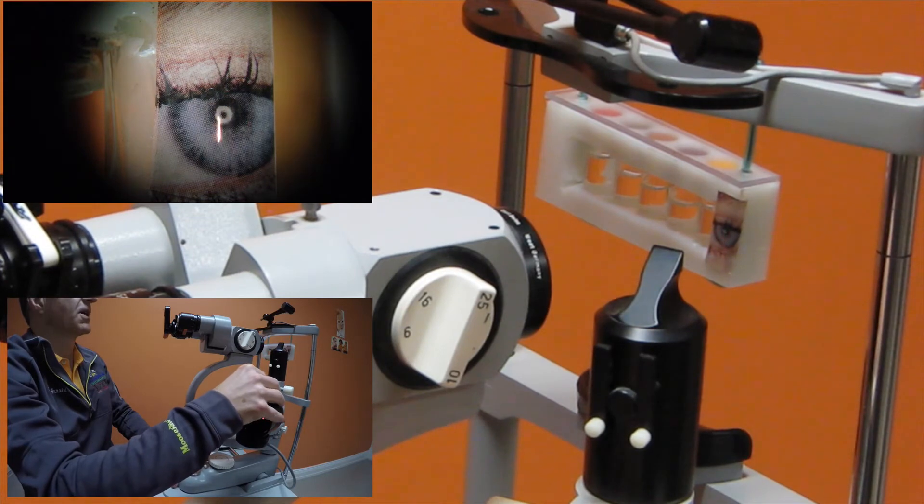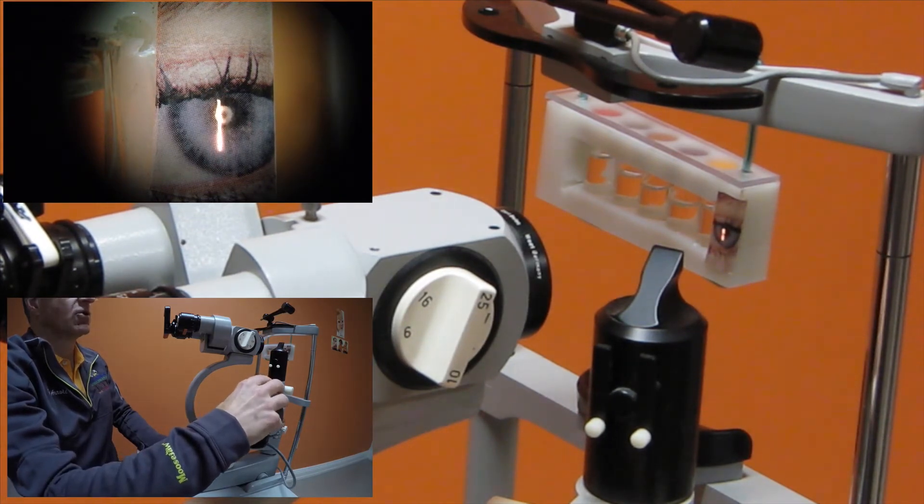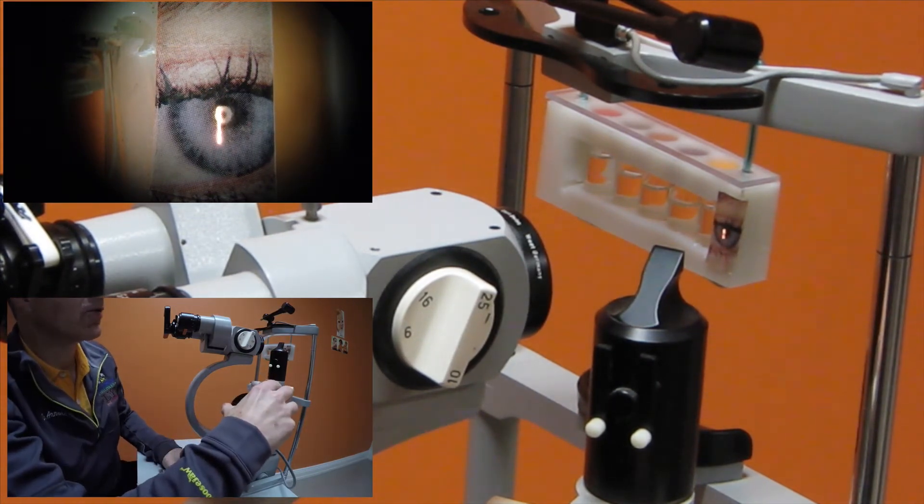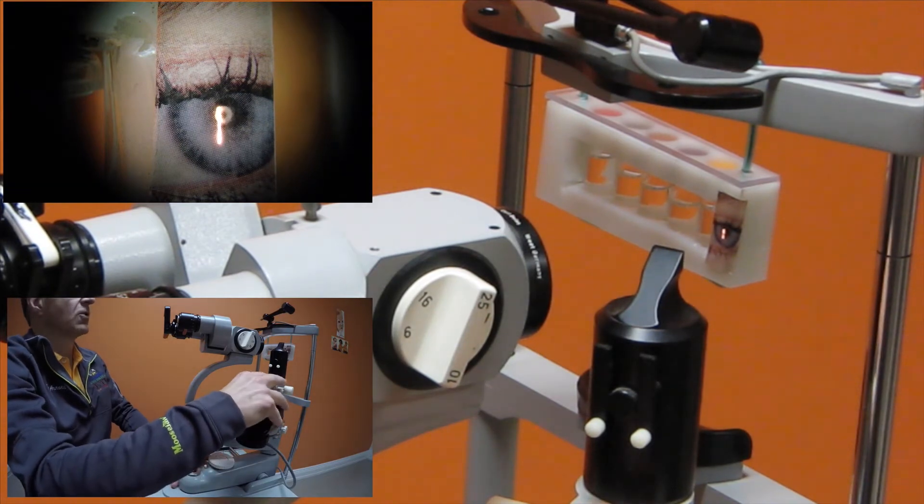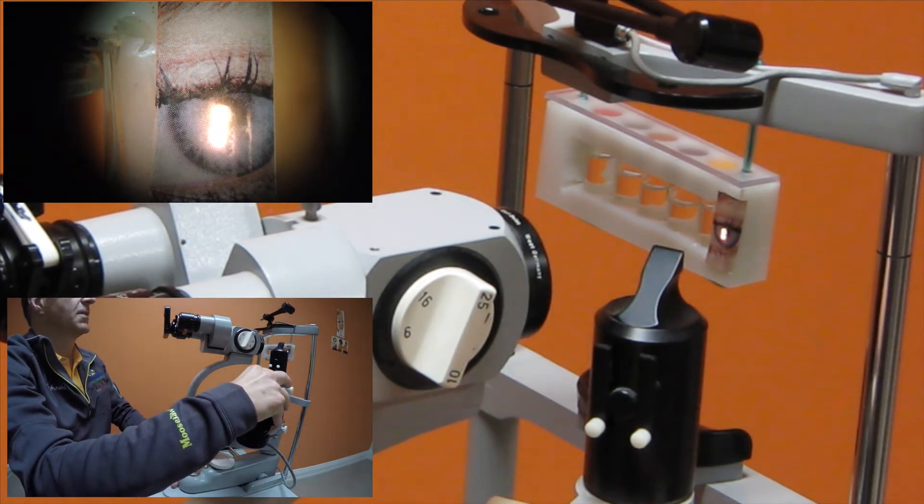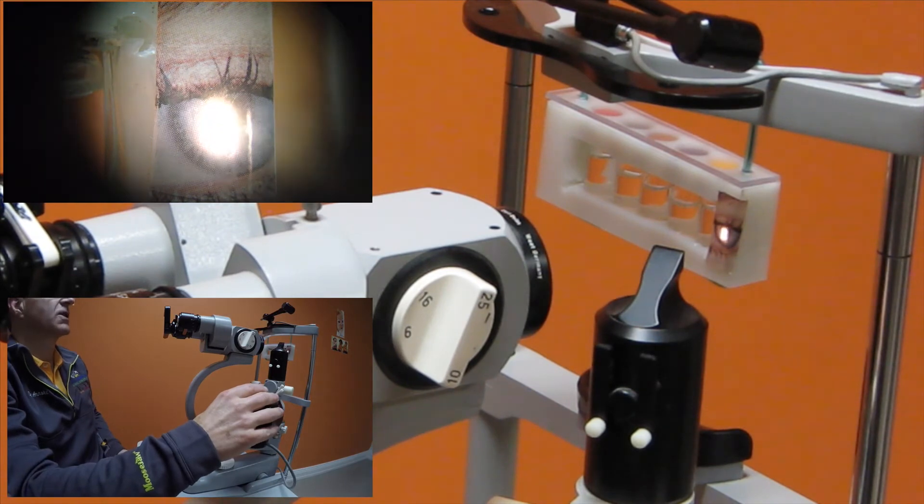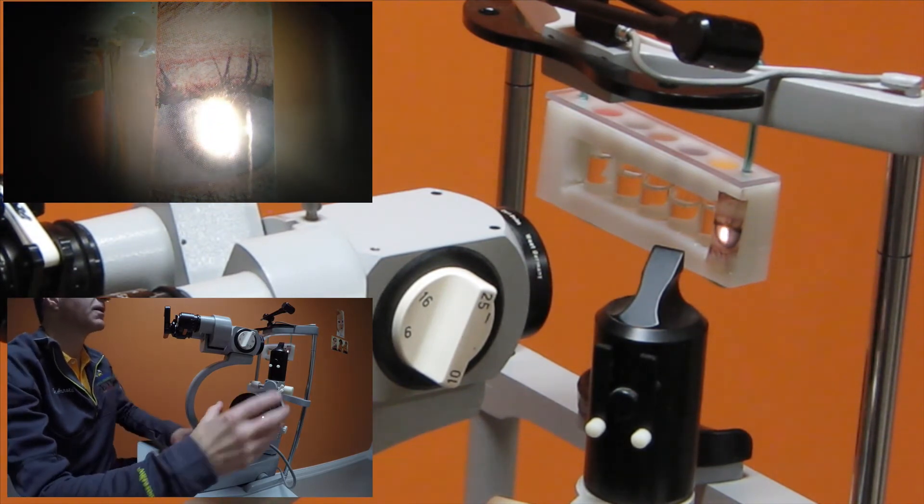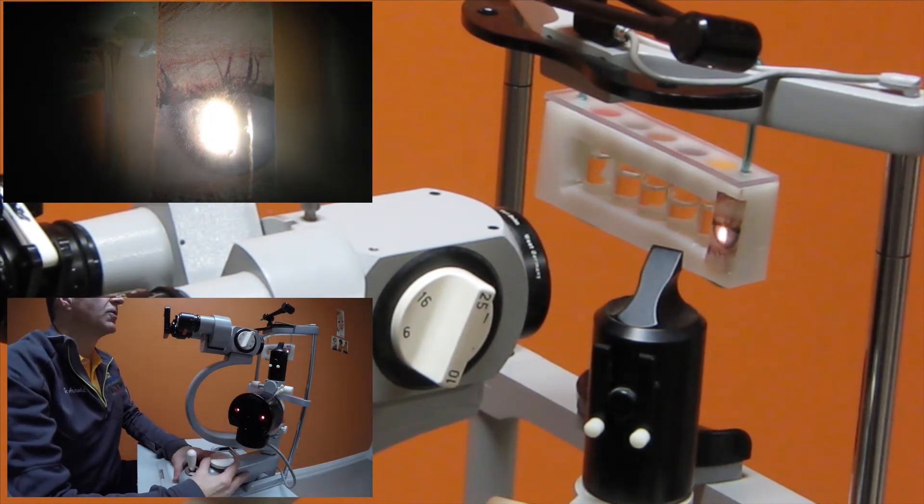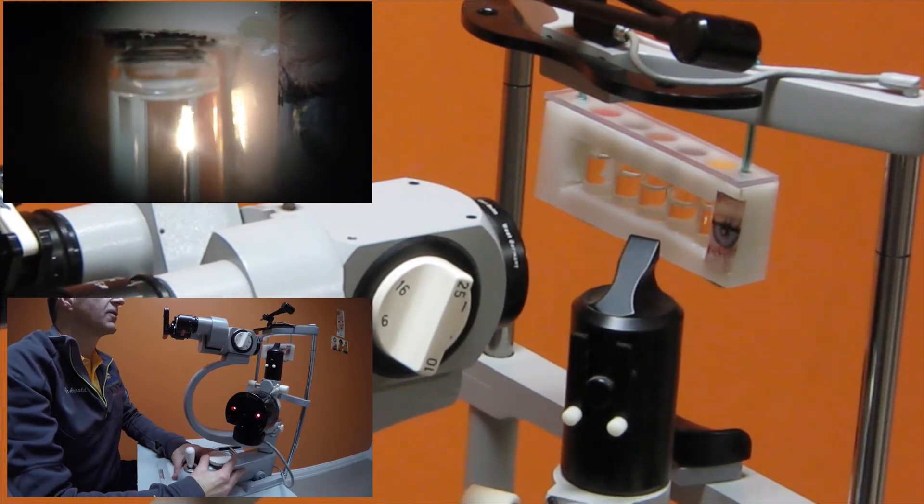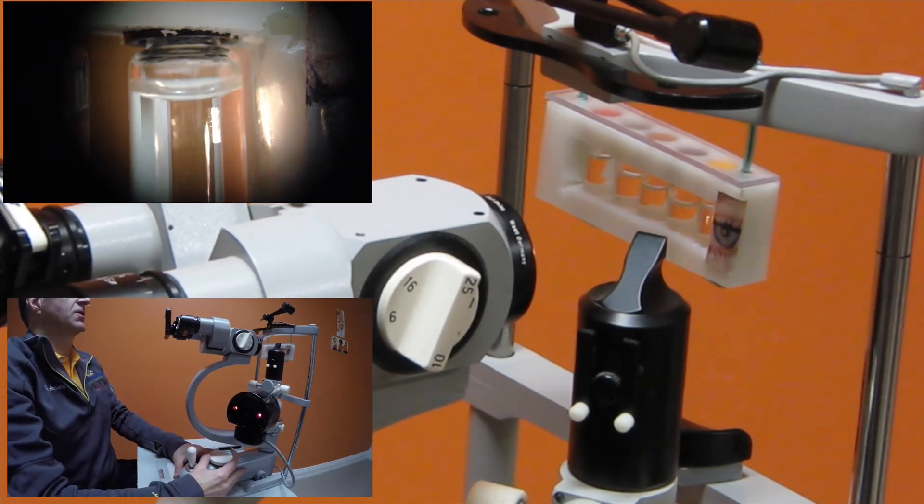We'll again let the beam go from a 9 to a 7 to a 5 to a 3 millimeter beam. We will increase the width of that beam and we're going to turn the rheostat up so that it's very bright. Now, we're going to move to the iritis test kit right over to the side.